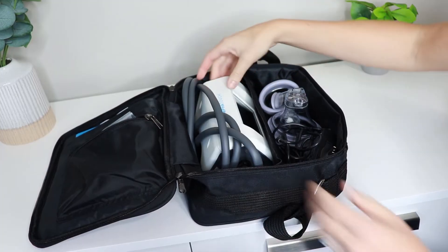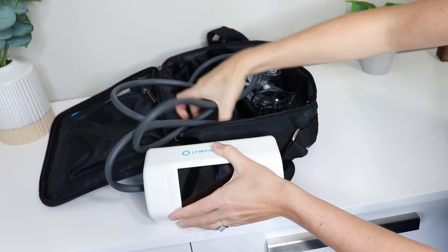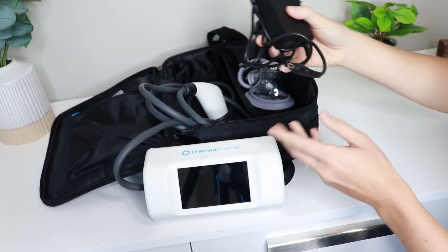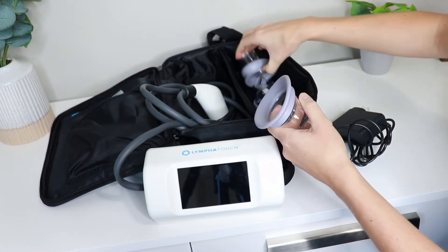On the other side we have the LymphoTouch itself. This is the size that it comes with. Here is the tubing, we have a plug to plug it in, and then this one has four different sections. They have different ones that someone can get based on what they may need them for.